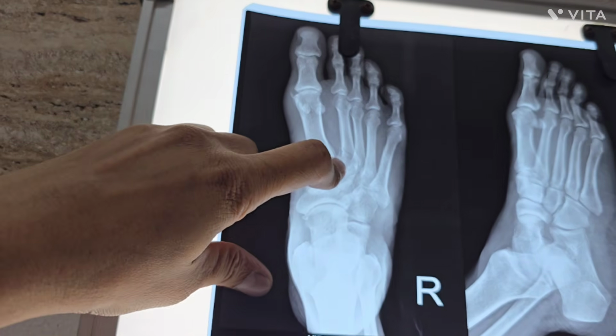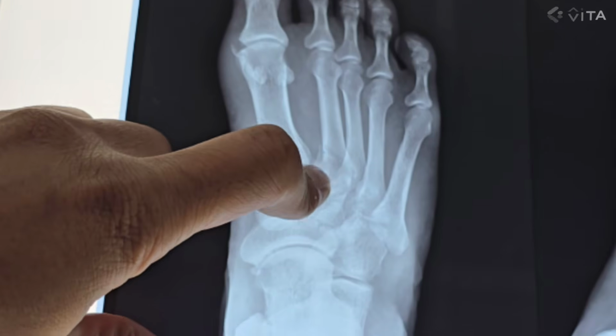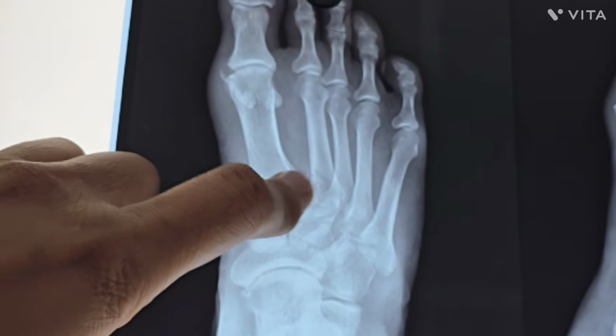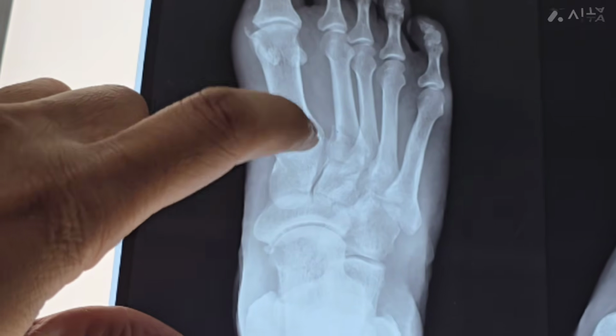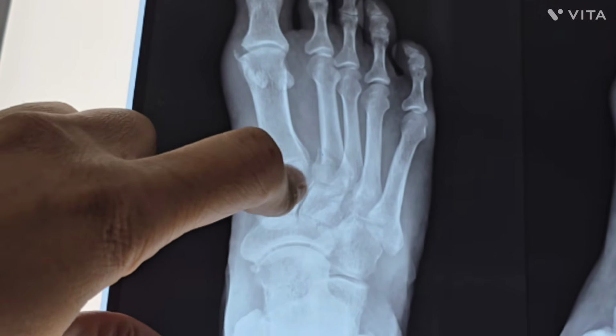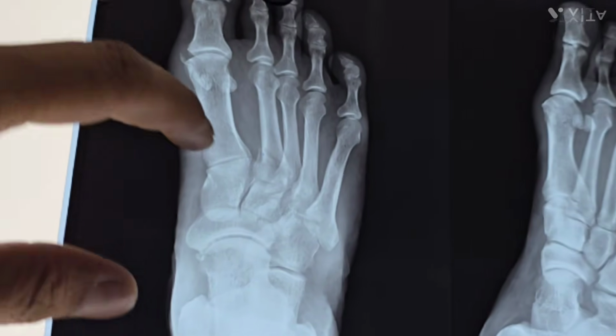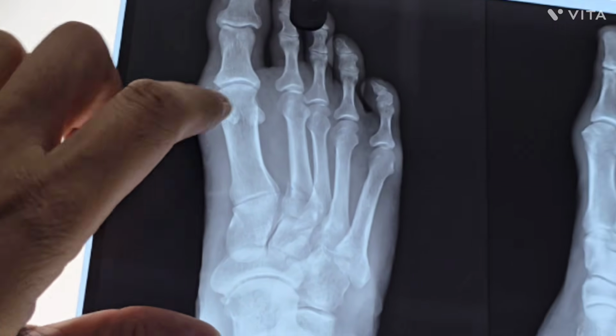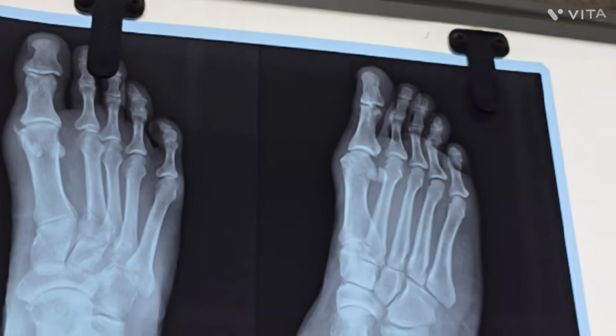Also there is a fracture of the second metatarsal base. There is a ligament called the Lisfranc ligament, which is attached from the medial cuneiform and first metatarsal to the second metatarsal. So this might be a case of Lisfranc injury or a proximal phalanx fracture.